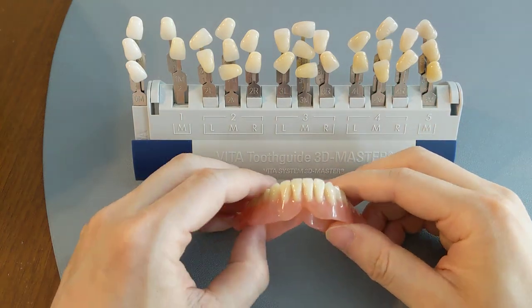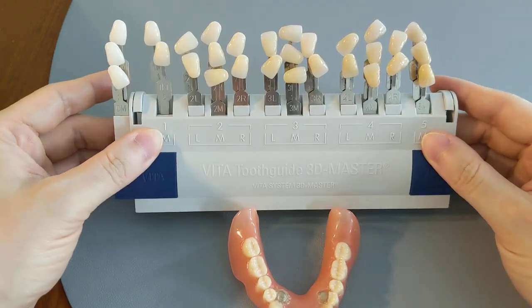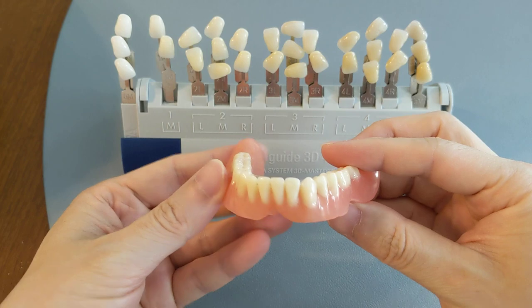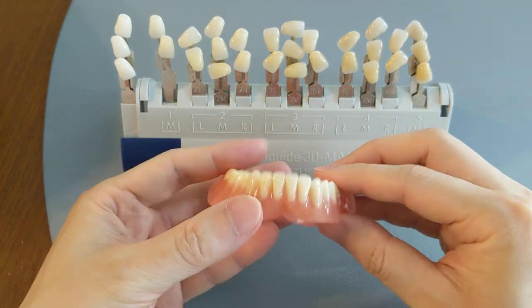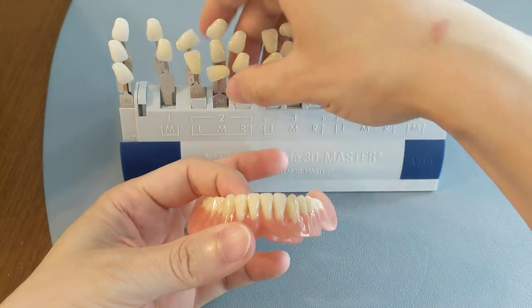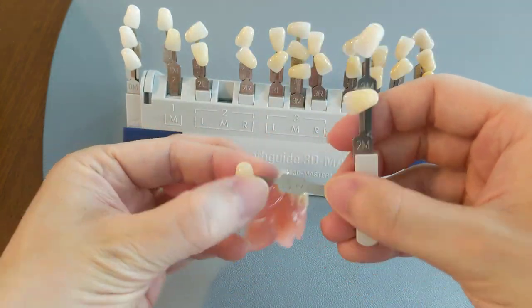I'm going to show you the whitest denture shades. So we have the shade guide up here and here we have some denture teeth — it's a sample denture that I made. The color for these denture teeth would be approximately like an A2 on the Vita classical shade guide.